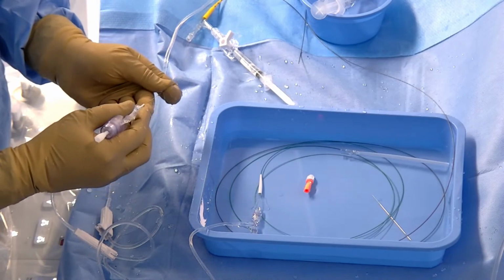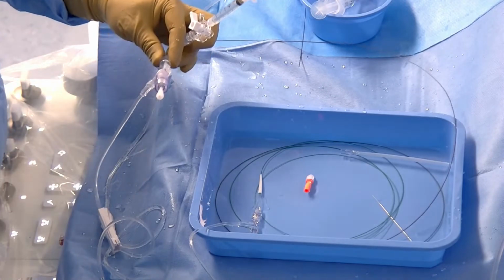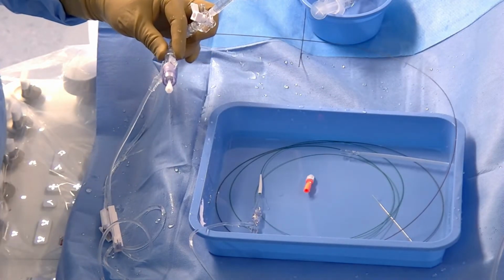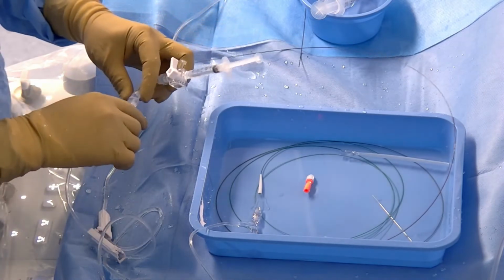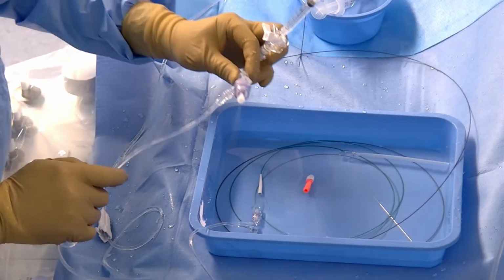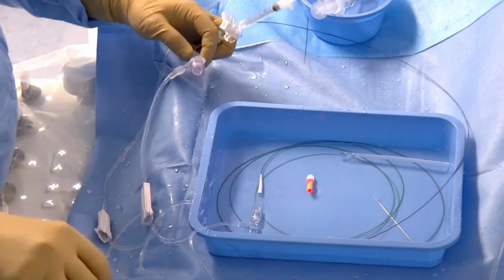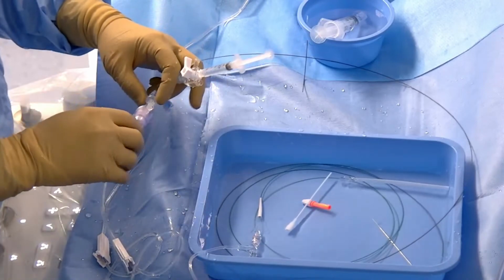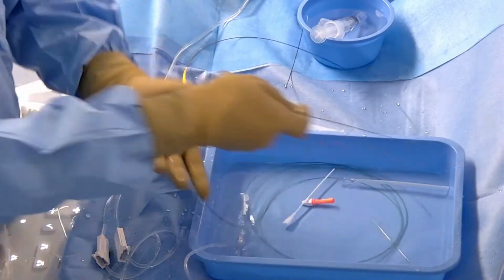And also the patient has a 360-degree kink on the cervical part, so-called tonsillar loop, and it might be a technical point in treatment of this aneurysm.